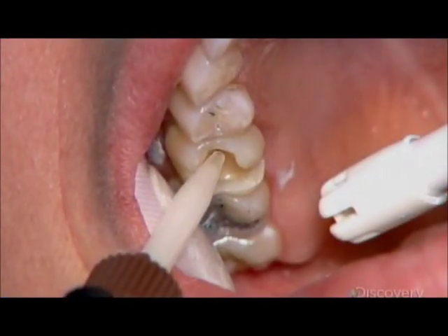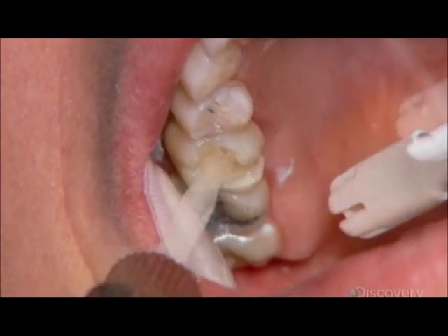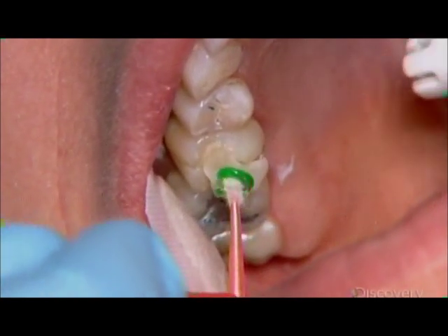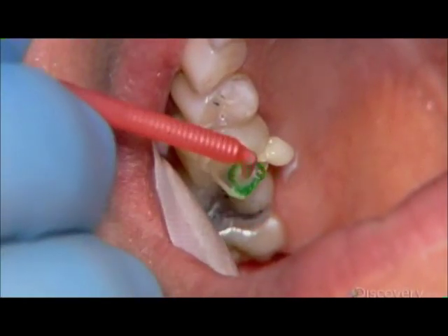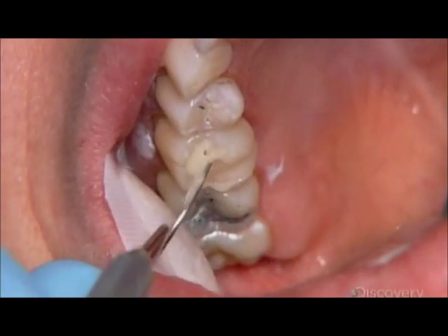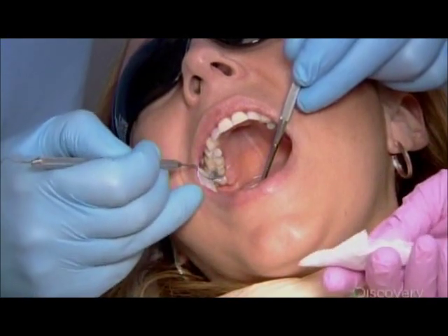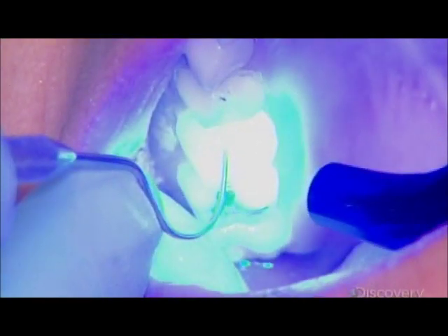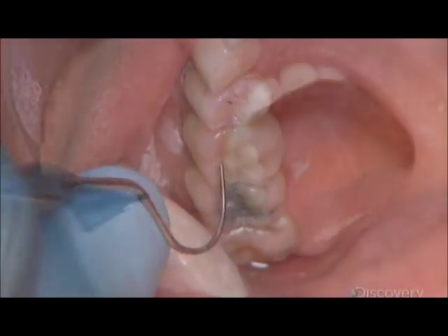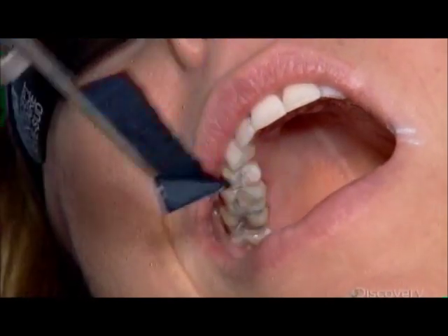The dentist injects tooth-colored resin cement into the cavity. He presses the digitally designed and milled inlay into the cement, then scrapes away the overflow. Halogen light on the dental work hardens the cement.